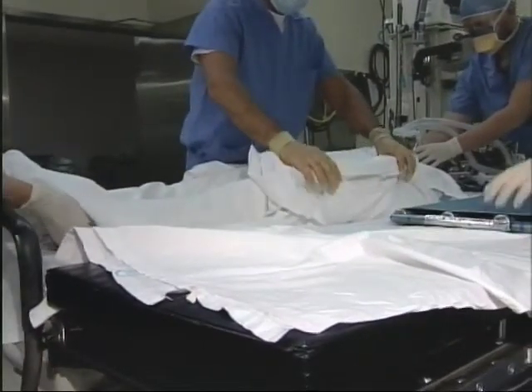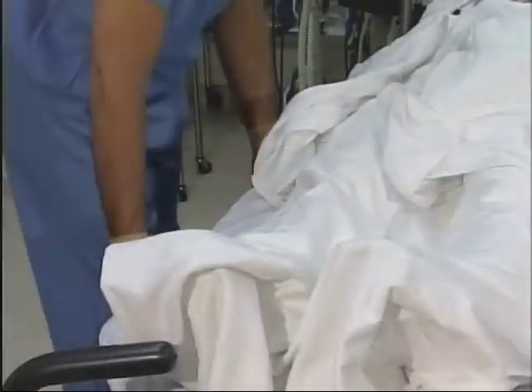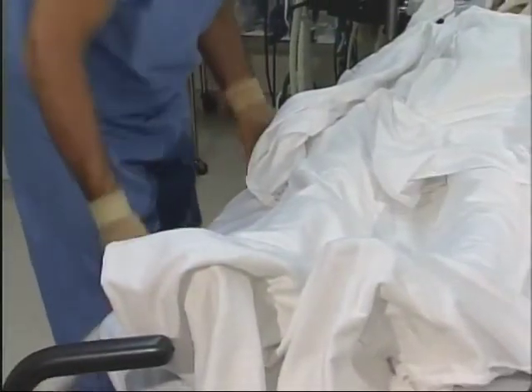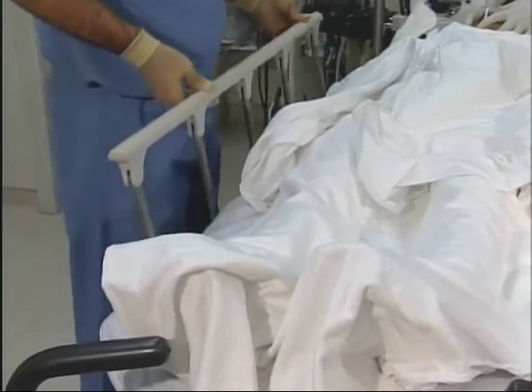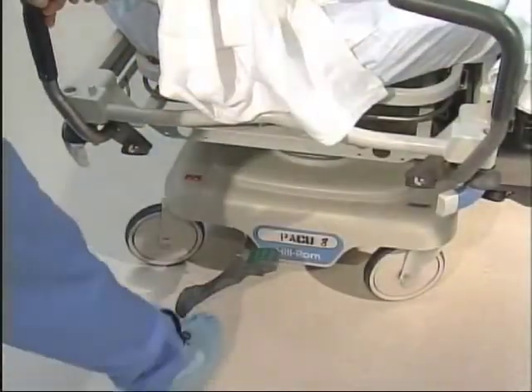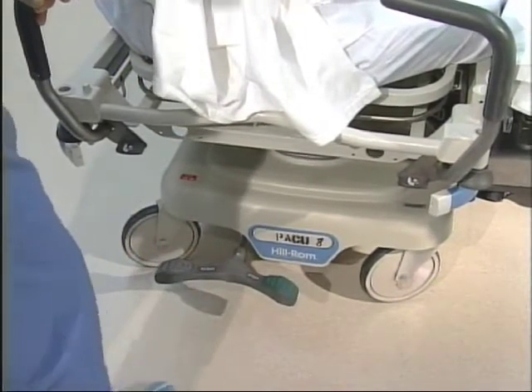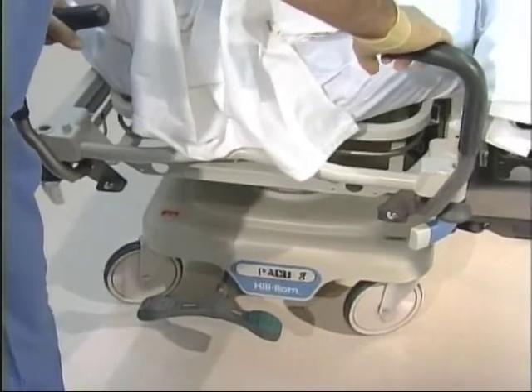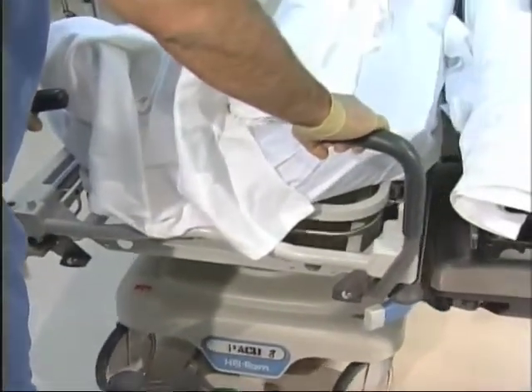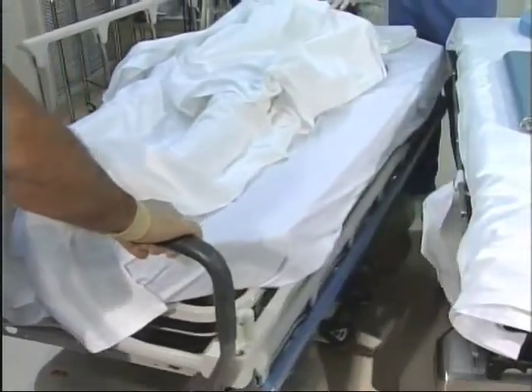The side rails are raised, the wheel locks released, and the patient is transported to the PACU when the anesthesia provider is ready. Note: additional personnel have been called in to care for the patient in the PACU. In this situation, it is not necessary for the STSR to accompany the patient to the PACU. Once the patient leaves the OR, the STSR begins breakdown of the setup.